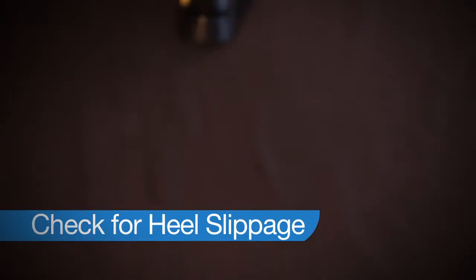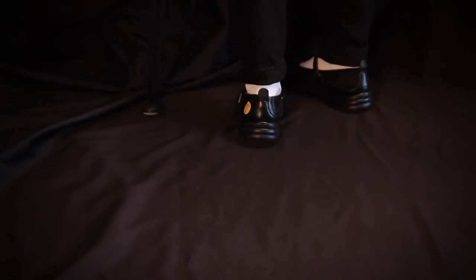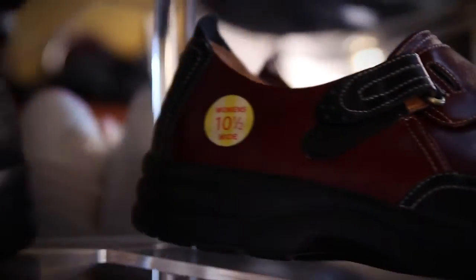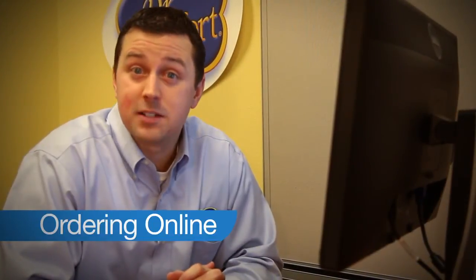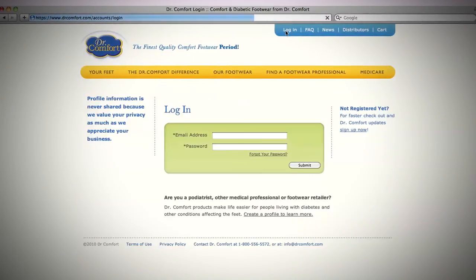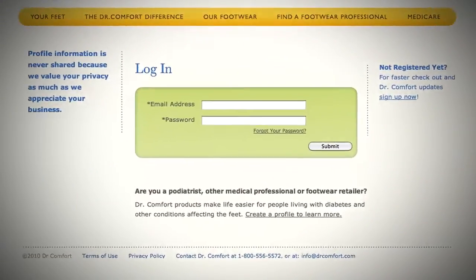As the patient walks around with the shoes on, observe for heel slippage, balance issues, or any discomfort the patient might experience. With Dr. Comfort, you have the option of ordering all non-custom products online. By simply going to our website at www.drcomfort.com and getting a simple username and password, you're able to place those orders quickly.